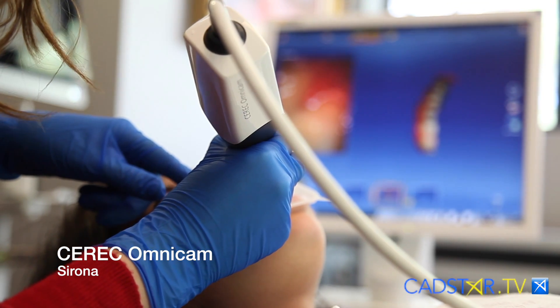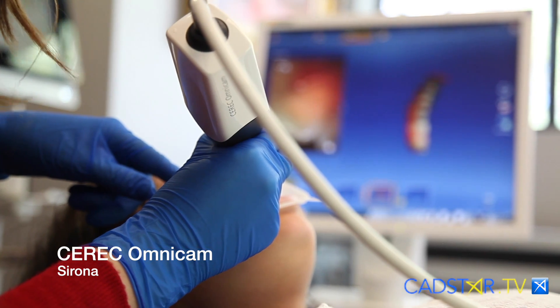I use the Omni-CAM — I love the system. There are several ways to grasp that margin visually with your camera. A lot of people pack cord. Cord's been around for hundreds of years. I used lasers for over 20 years.